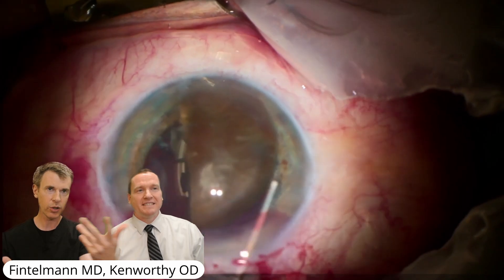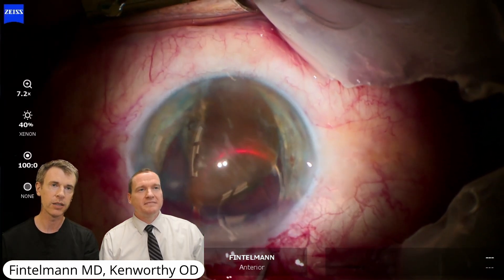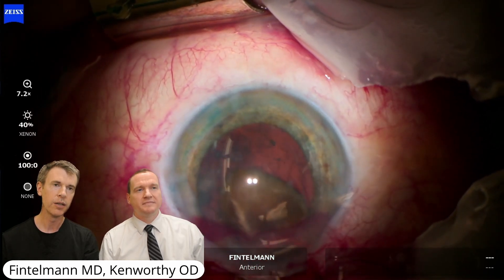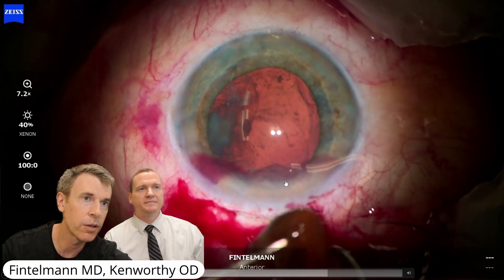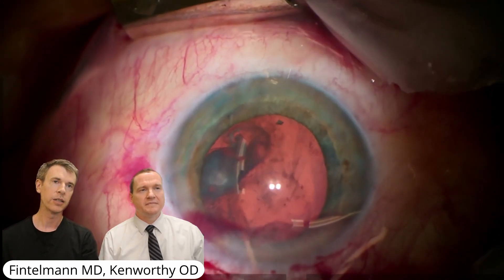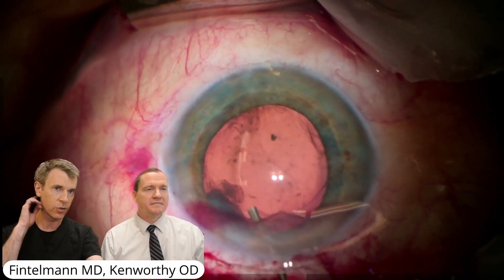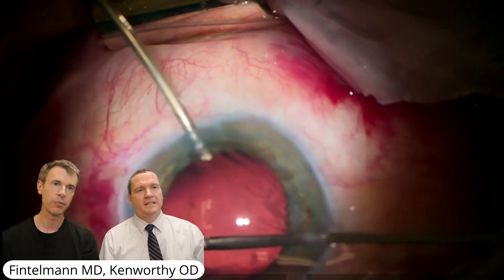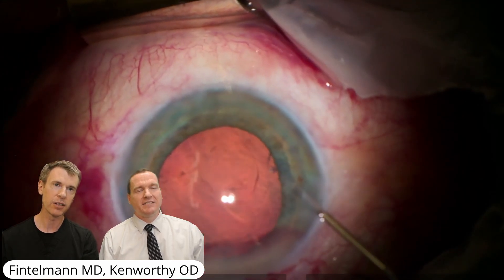Always surrounding with viscoelastic to protect the cornea. There's usually a small layer of viscoelastic between the cornea and the lens piece, and here it comes out in one piece delivered to the main incision — much easier if it's smaller. This patient was already vitrectomized. You see some remnants of the bag right there coming out. There's no vitreous because the patient was already vitrectomized. The rest is just hydrated out as little lens fragments. The patient at the end is left aphakic. Just to be safe, I do a vitrectomy to make sure there's no vitreous based on assumptions.